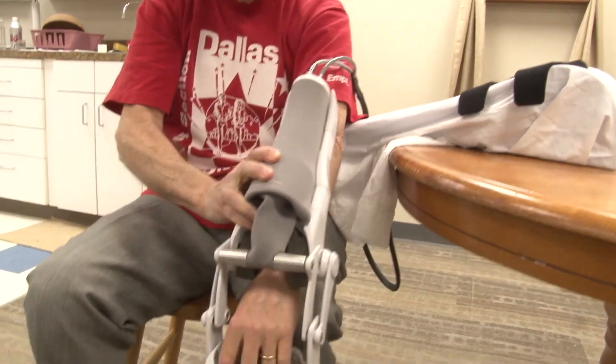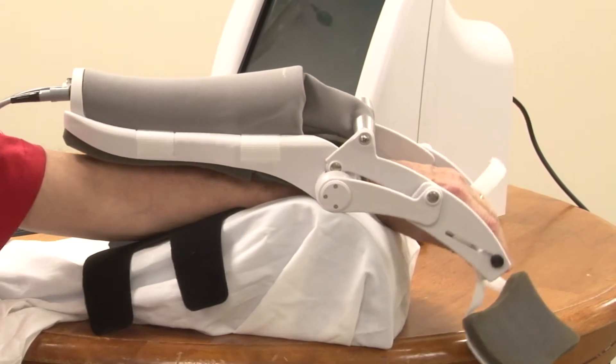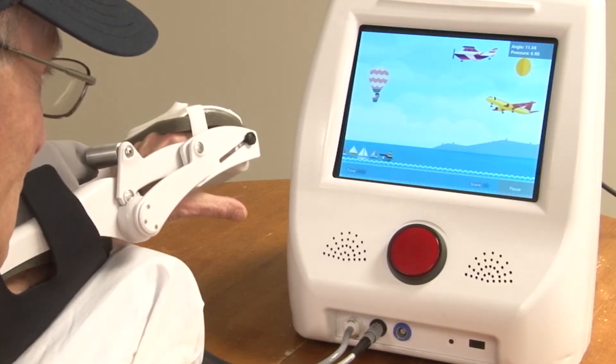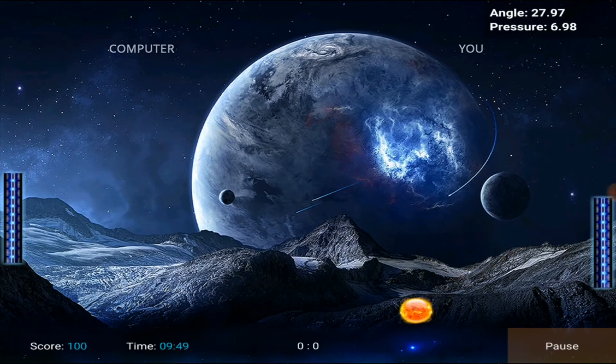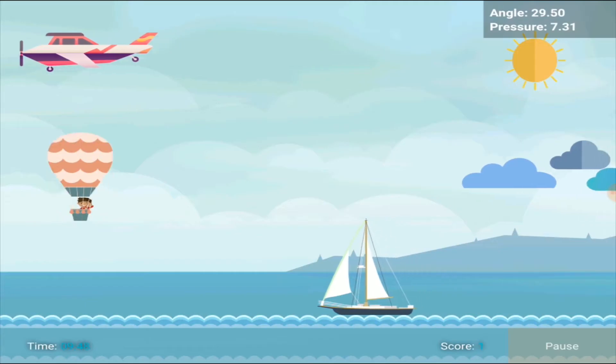Stroke survivors who are experiencing paralysis or paresis as a result of stroke will be guided through various exercises incorporating fun interactive video games that help stretch and safely guide you through upper limb rehabilitation.